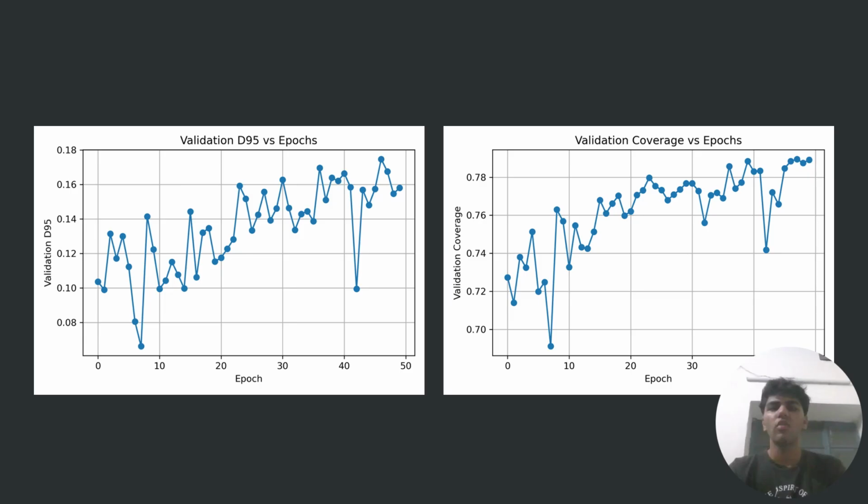These are in normalized units. So this is expected because RL signals are inherently stochastic, inherently meaning they are random, especially early in training. What matters is the overall upward trajectory, which indicates that the agent progressively learns to improve tumor dose coverage in a clinically meaningful way.